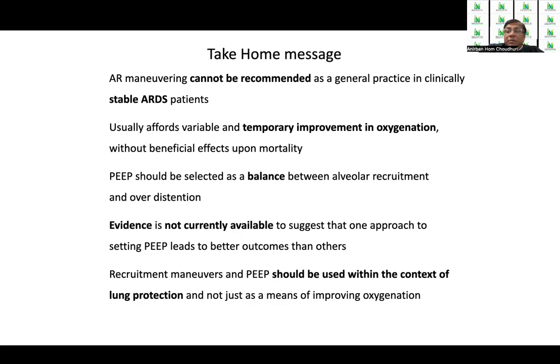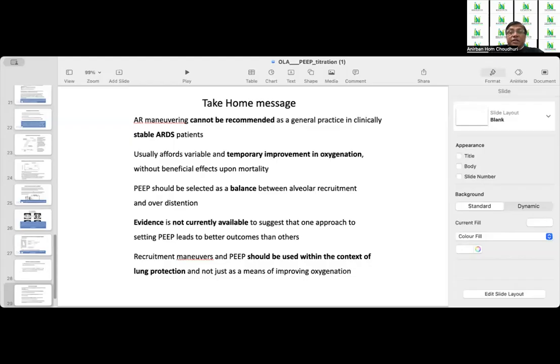Because if we are not able to protect the lung by making all the other recommendations, then all the benefits of PEEP will go wasted, and instead all the harm will manifest. And it is not just a means of improving oxygenation.